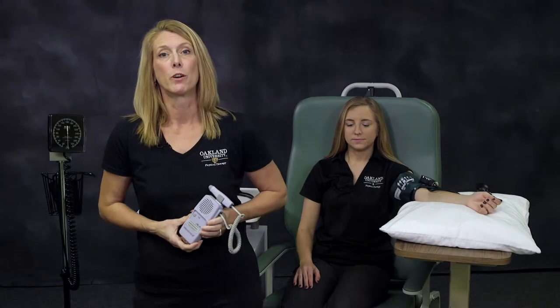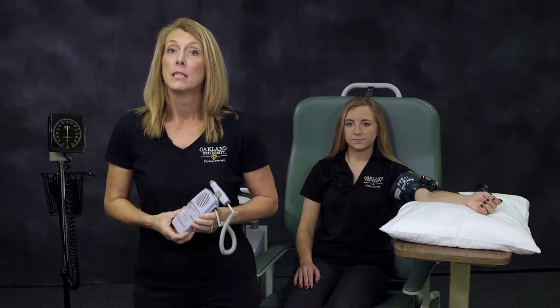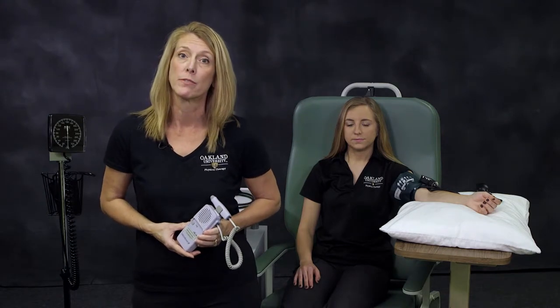A handheld Doppler may be a useful resource for a physical therapist when obtaining a systolic blood pressure measurement. Specifically, situations for which the artery to be auscultated is situated in an area with an irregular anatomical surface — for example, at the posterior tibial artery — a Doppler may be useful. Additionally, a Doppler can be helpful when Korotkoff sounds or pulse pressures are inaudible or difficult to palpate.